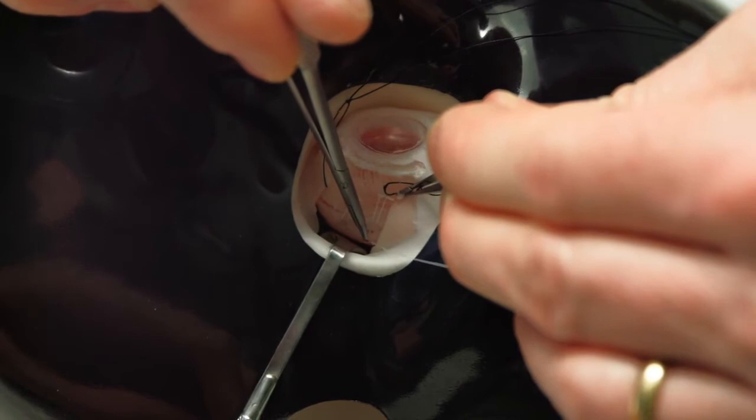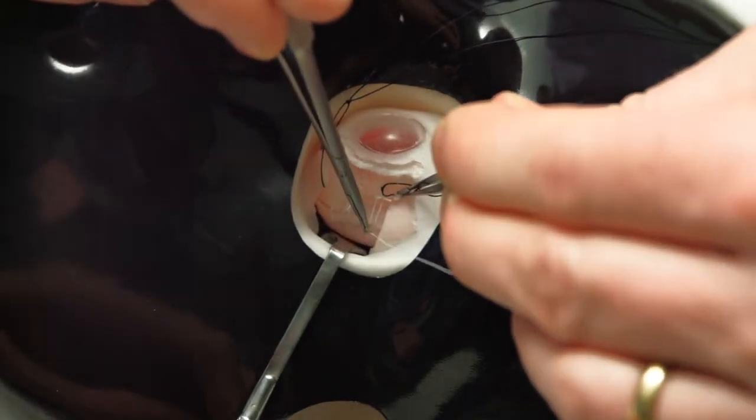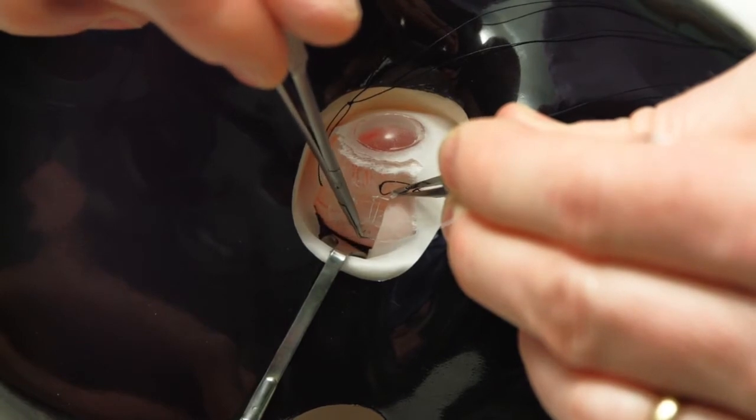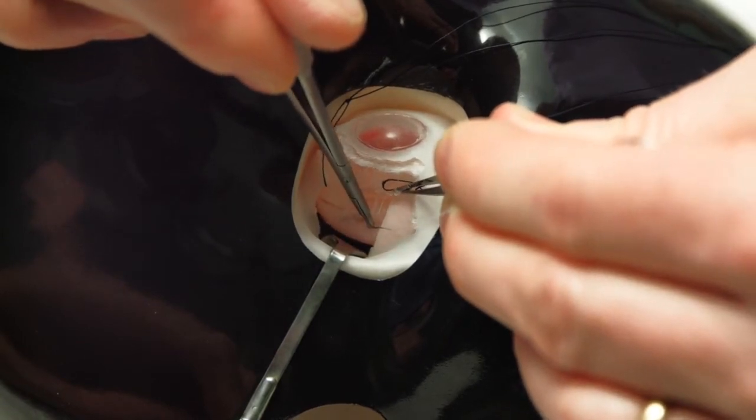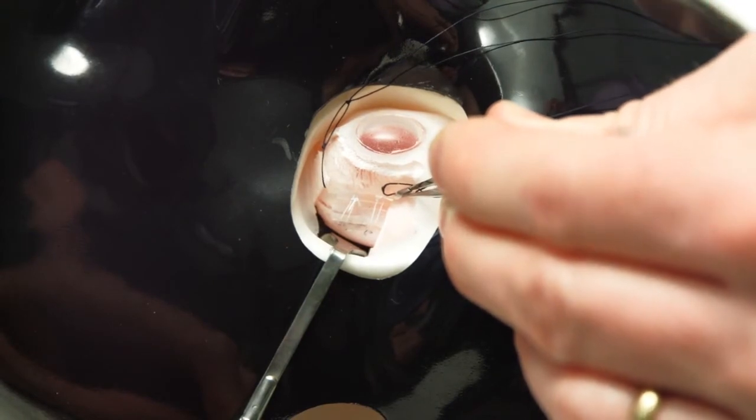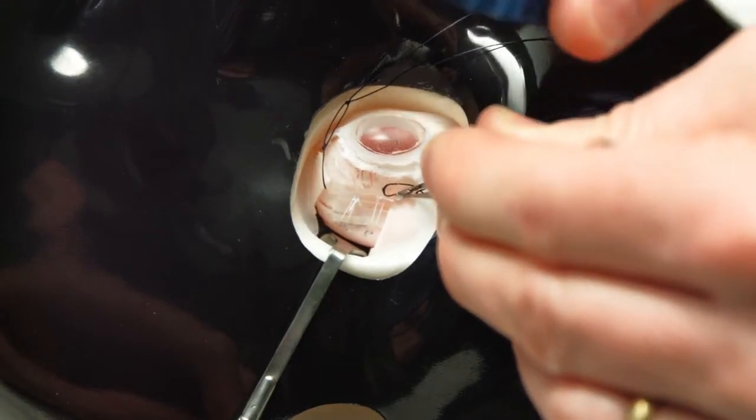All the time the eye also has to be pressed on and grasped firmly with the St. Martin's forceps near the muscle insertion ideally, and pressure applied to the eye as soon as the needle comes out. This reduces the chance of internal choroidal bleeding or subretinal bleeding.